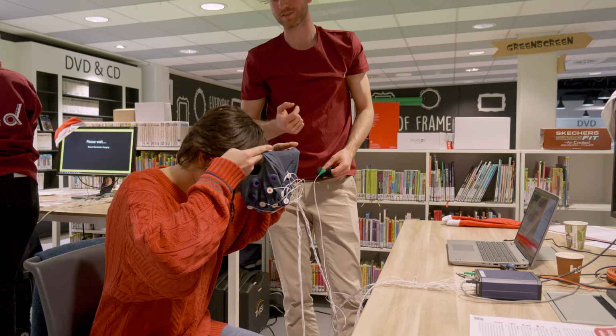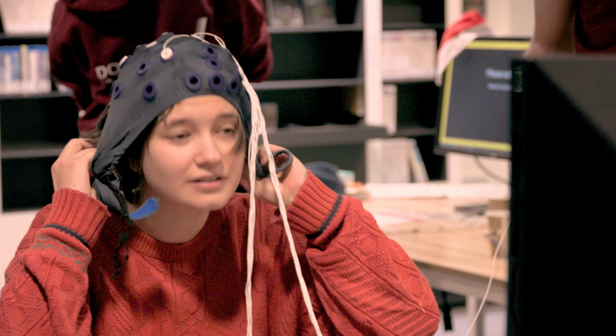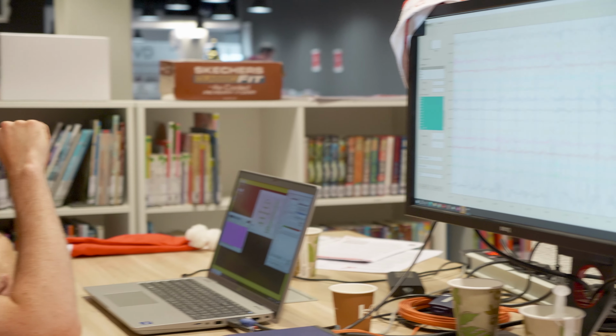Participants are really important for us, simply because, of course, we need to test these algorithms. You can see your live brain activity on the screen, and you can actually communicate via your brain activity. So this is actually quite a wow factor.